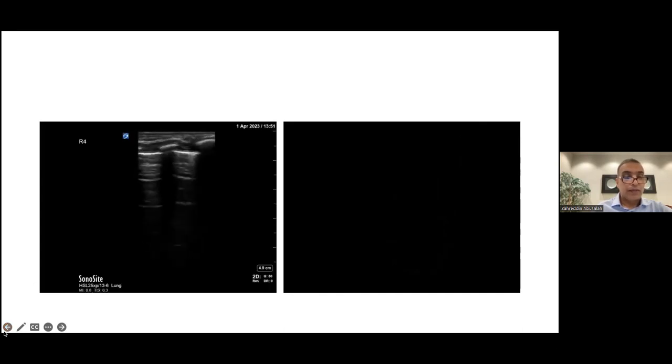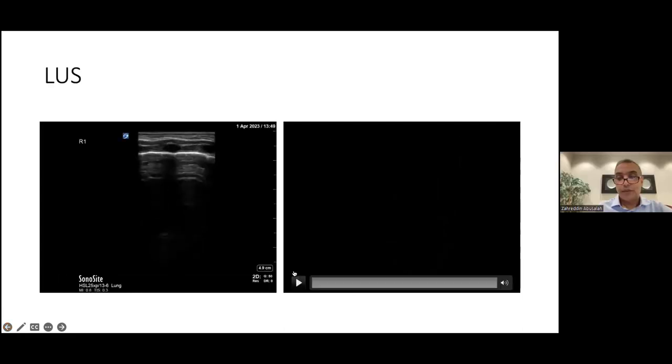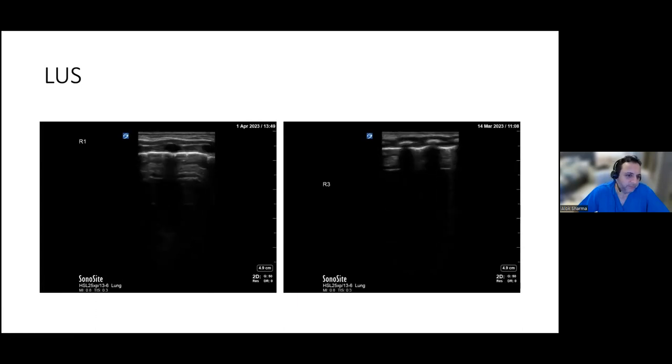Just go back again. Yeah, no problems. Here we are. R1. So again, we're just losing sight of the depth for the deeper part. My gut feeling is you could actually come down to 4 and put your gain up, and your gain going up will basically give you the depth much better.